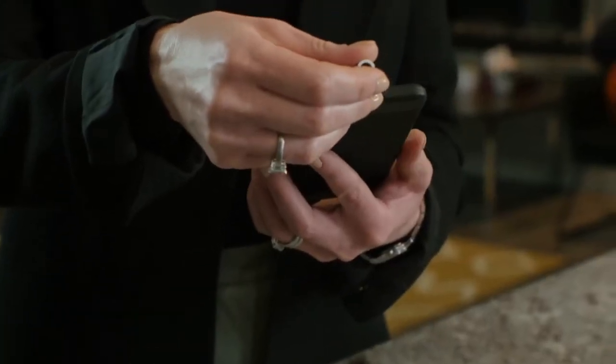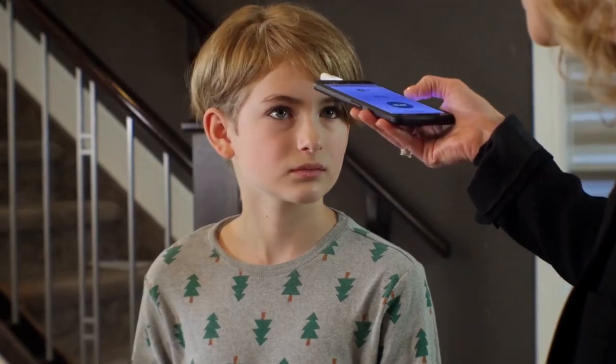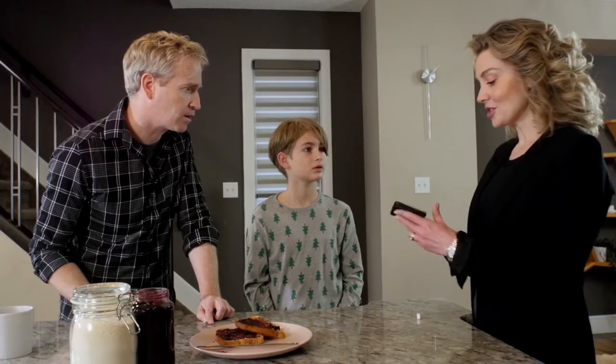Huh. Can I put that in my mouth? No, it goes in my phone, which also powers it. No more batteries? The app just pops up, and in half a second I have your temperature. That was quick. Really quick. Well, you don't have a fever, but I'll open a profile for you in the app so that we can track your temperature over time.